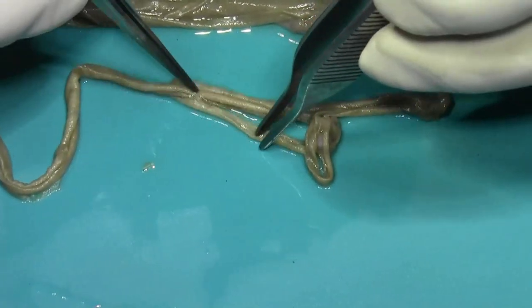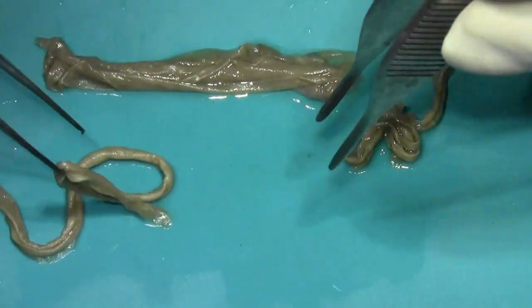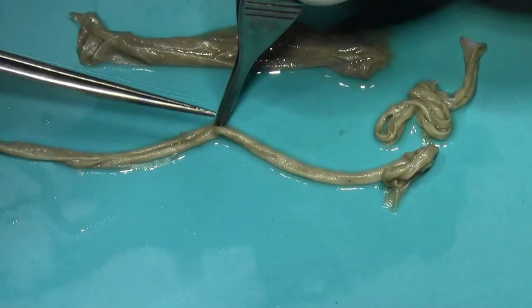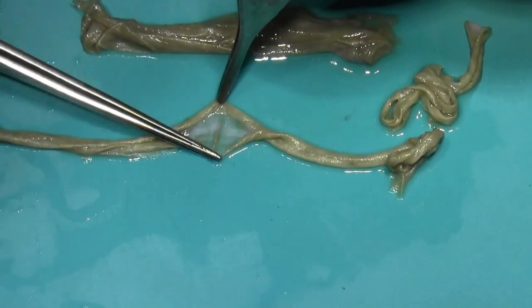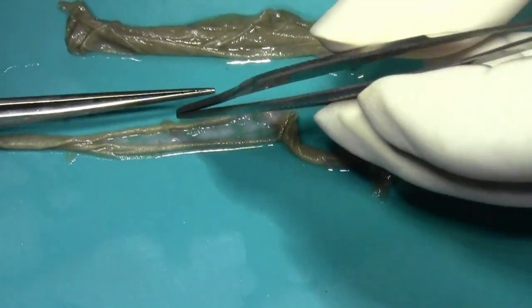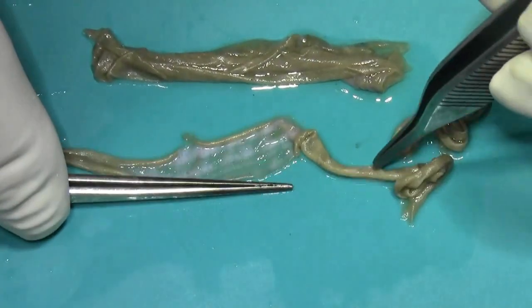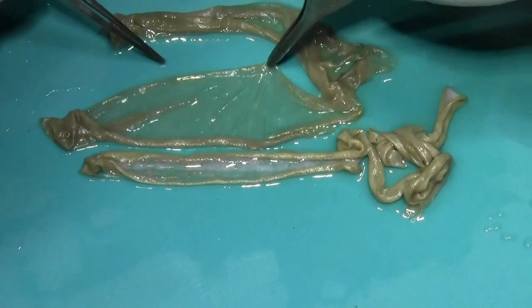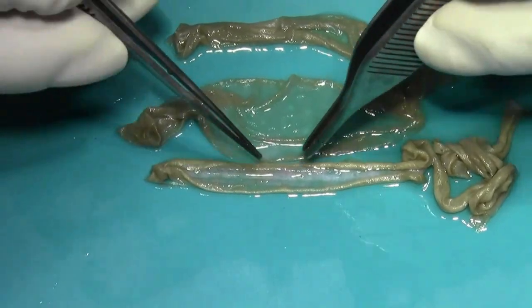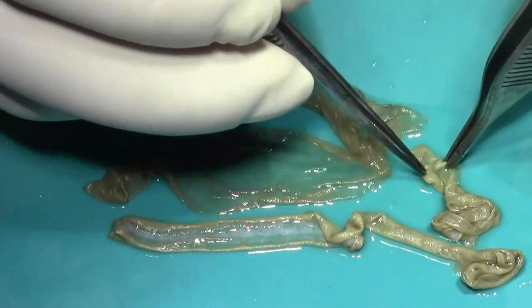This appears to be a thick graft — you can see it has rolled inside. Notice the dermis here. This is the thick split-thickness graft; it has a small but visible amount of dermis, in contrast to the ultrathin graft we saw previously.